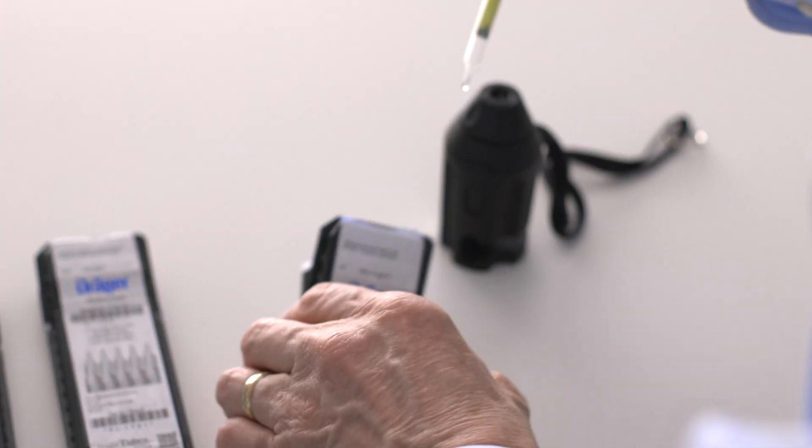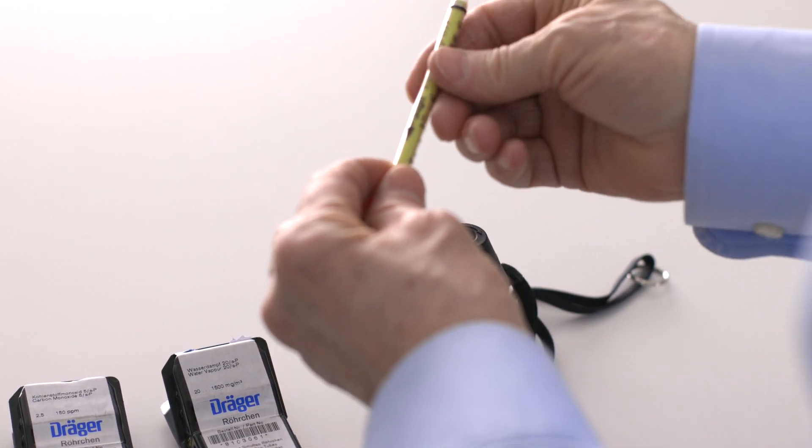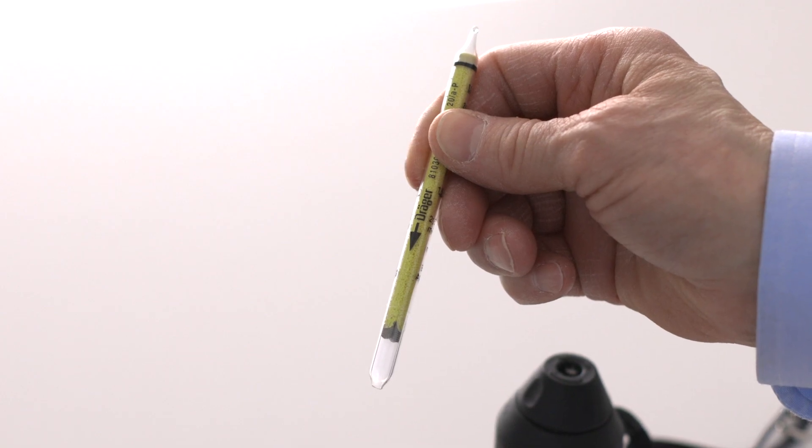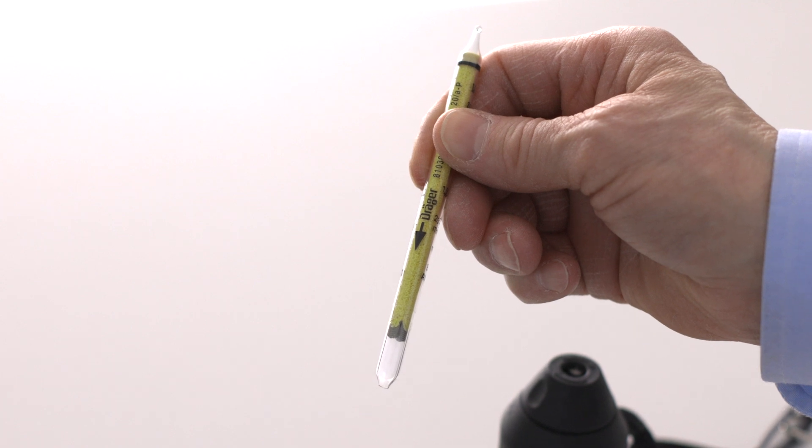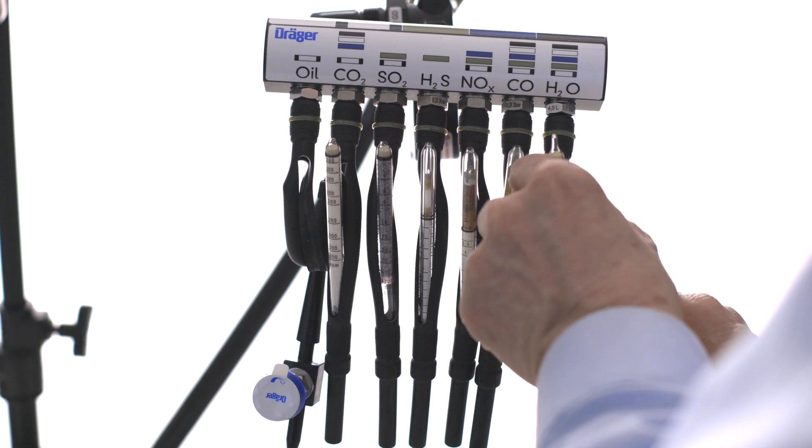Finally, take one of the water vapor tubes, removing only the tip from the outlet end of the tube at this time, which is the end the arrow points towards. This tube is extremely sensitive to ambient humidity, so we won't remove the other tip until we're ready to start the test. Insert the tube into the holder, leaving the top part disconnected.